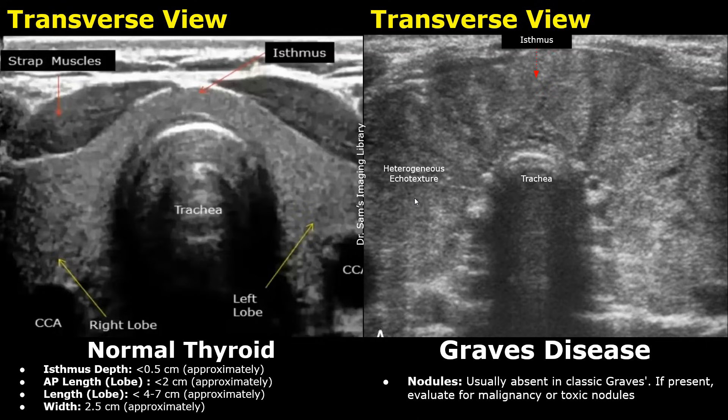Nodules are usually absent in classic Graves' disease, but if they are present, it is important to rule out malignancy or toxic nodules. This absence of nodules can be helpful in distinguishing it from Hashimoto's thyroiditis. Hashimoto's thyroiditis and Graves' disease have some overlapping features on ultrasound, but a nodular appearance is more common in Hashimoto's. Of course, we correlate these ultrasound findings with lab findings, which help in differentiating between Graves' disease and Hashimoto's thyroiditis.